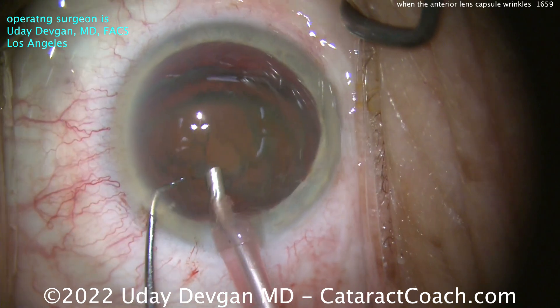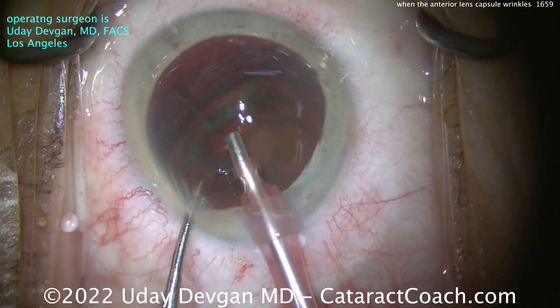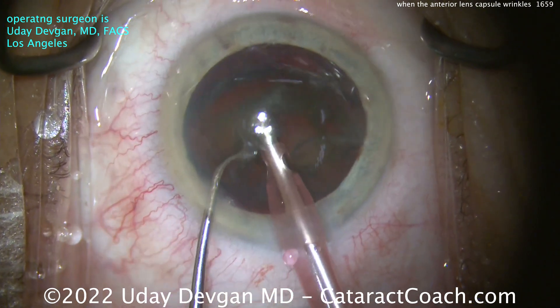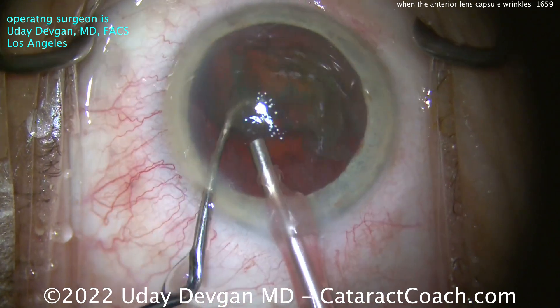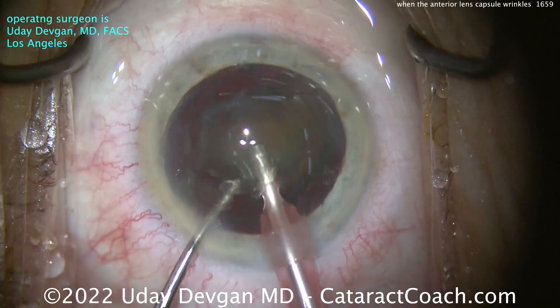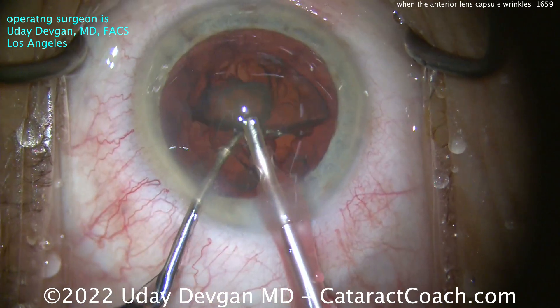The phaco probe goes inside the eye. We can buzz right in the middle, chop that in half. Nucleus removal is going to be pretty efficient. This is an unedited case — a little bit more than 6 minutes, so reasonably efficient. Taking the cataract pieces out — not a super dense cataract despite the patient's age; this patient is almost 90 years old. I'm going nice and slowly, keeping an eye on things, making sure the capsule bag is not floating around too much or flapping back with the fluidic currents. Get that nucleus out of the eye pretty quickly and efficiently — and it's completely gone.